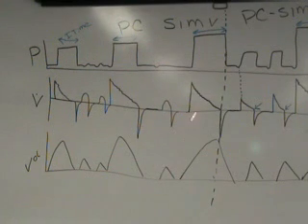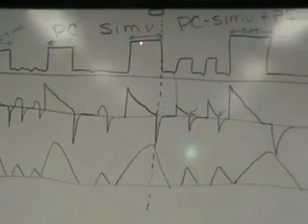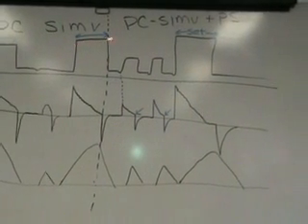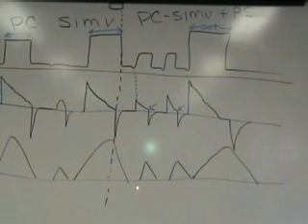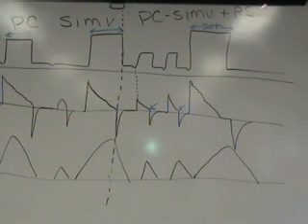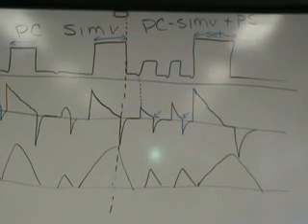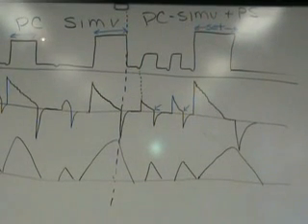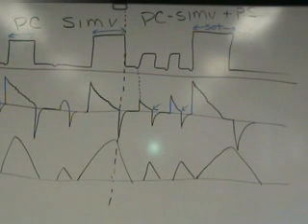After this breath, you see that I have one spontaneous effort, one spontaneous flow rate, one small tidal volume, and then it was time for the SIMV to give a big machine breath, and it gave that big pressure-controlled breath for the set I time. I get the same flow pattern and a big volume delivery. Well, at this point, we've added pressure support. Okay, we'll just call that 10 centimeters of pressure support. I didn't put the numerical values on here. And remember, these pressure control levels are supposed to be the exact same level. Okay, I'm not an artist.